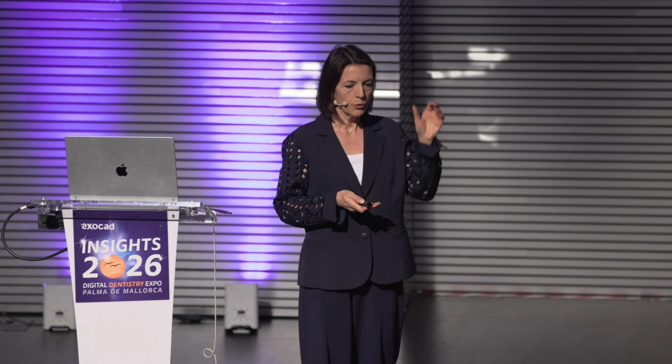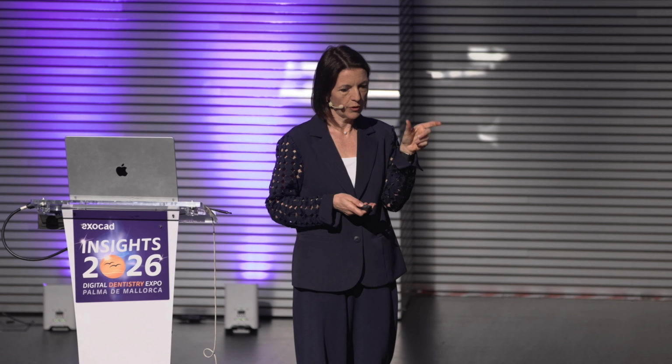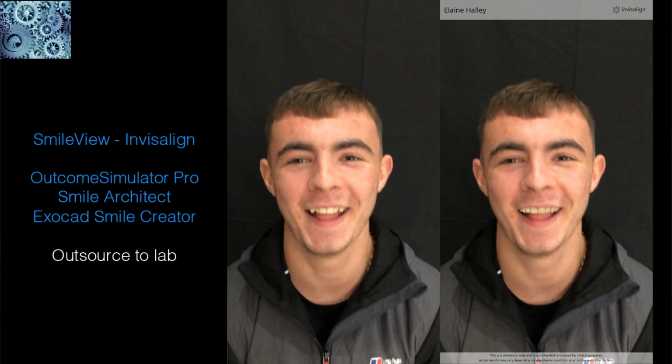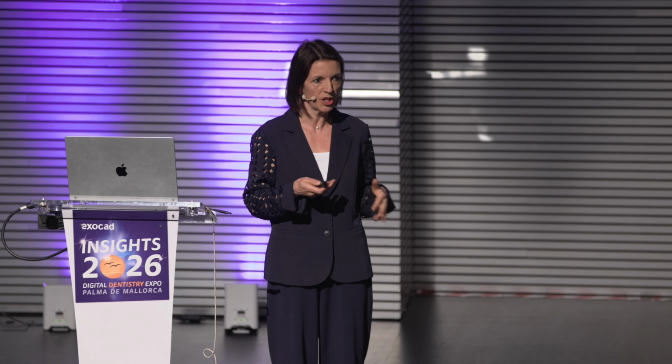So all of these, I call them emotional touch points, all of these systems give us the ability to visualize our potential treatment plan in the patient's face. And that by default helps the patient understand the potential of the treatment that we could do. But first and foremost, it helps us make sure that we could actually deliver it. And technology is speeding ahead here. You'll all see AI video images, AI where you can put in just a 2D picture and the patient starts moving, even although it isn't them.